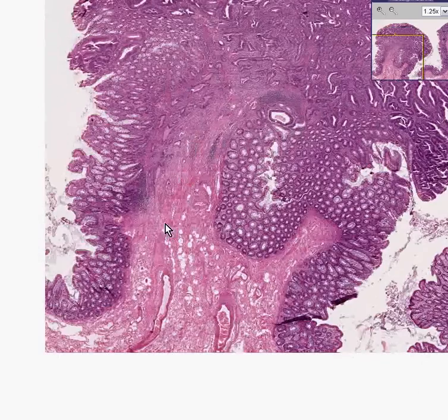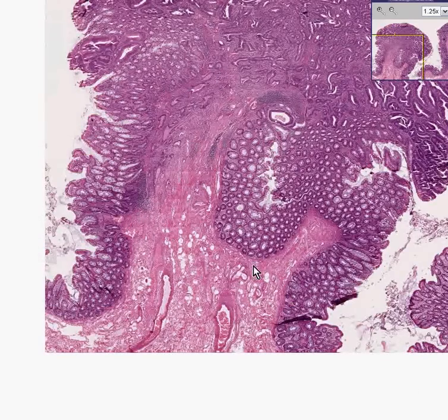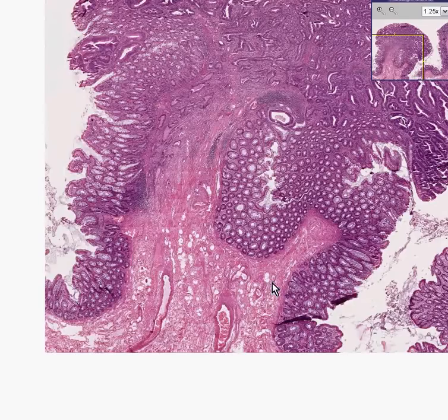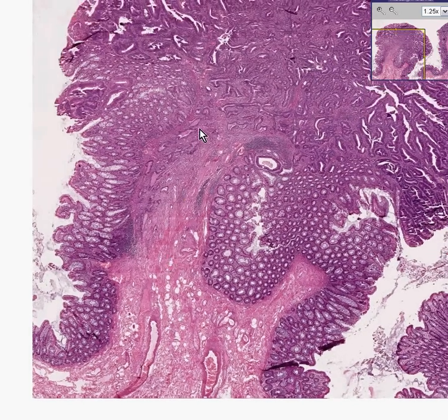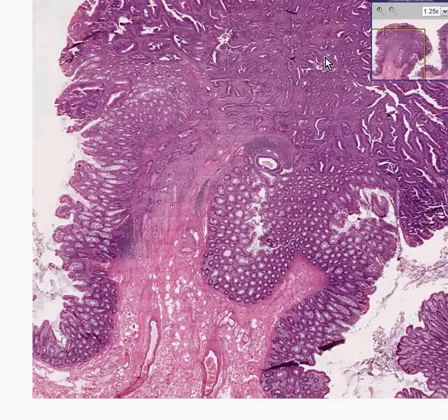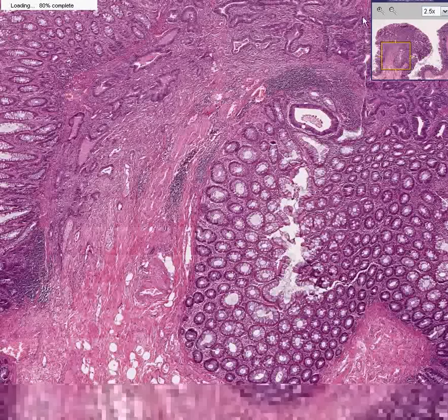Whereas if you were to examine this part of the stalk or cut this part, you might tell the surgeon, "Oh, don't worry, the stalk is okay." Well, maybe the edge of the stalk is okay, but there are glands out here and out here in which cancer has invaded the stalk.